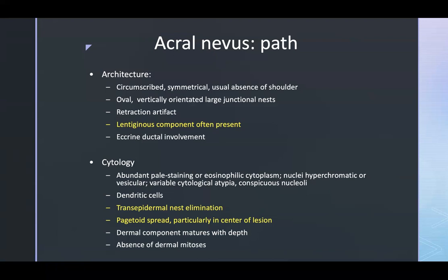So that's where I really got my interest in PRAME, was this acral melanocytic nevi and melanoma project, where I saw firsthand how sensitive and specific PRAME can be as an immunohistochemical screen. And oftentimes we do not get very good biopsies from acral lesions because it's a difficult spot to biopsy. You may have some small samples. So having an immunohistochemical stain that can help you give a molecular malignant status to the nevus and have you rely a little bit less on architecture can be very important to take into account when you're trying to make the diagnosis.